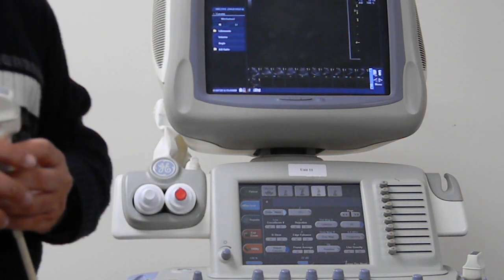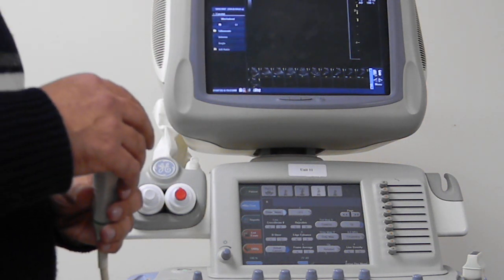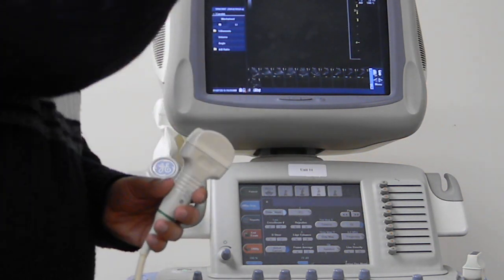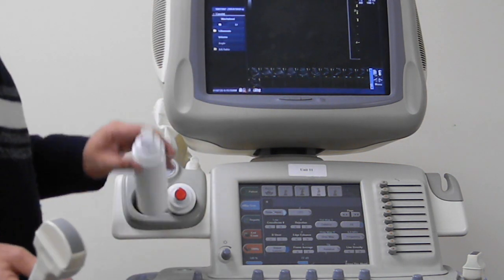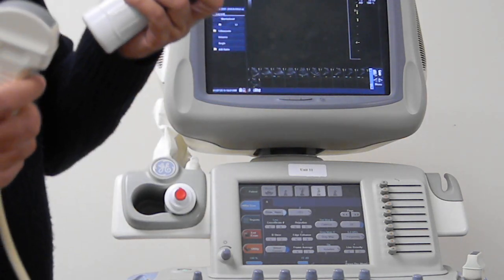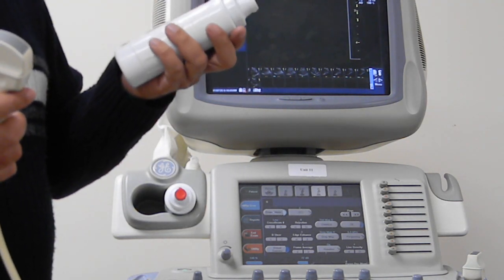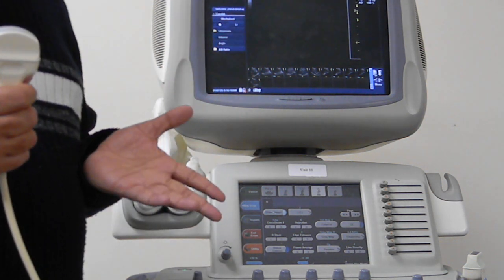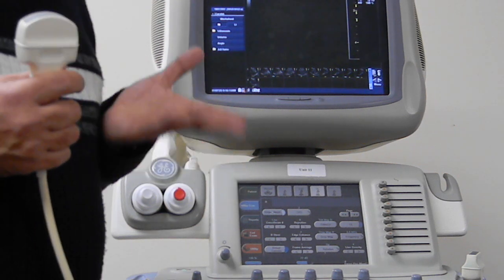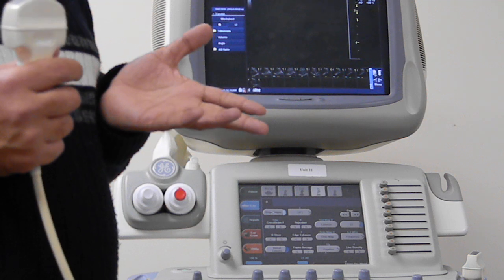Next. Retrieving report. Huh? Retrieving report. We just did that. That's the same as, yes. Reason for gel. Your ketchup or mustard or whatever you want to call it, for your ultrasound machine. And I gave you the reason yesterday. The reason was primarily to reduce impedance.